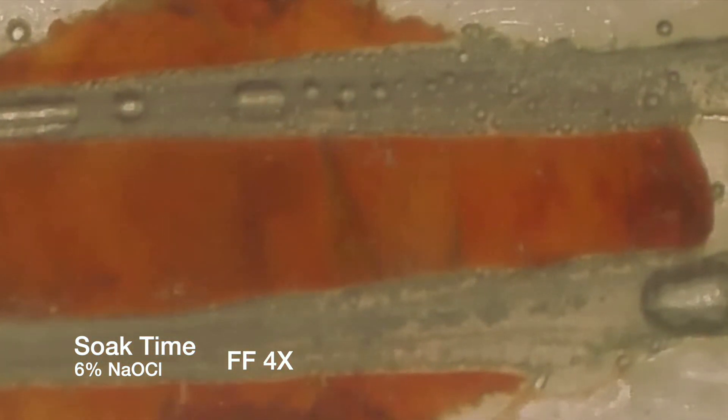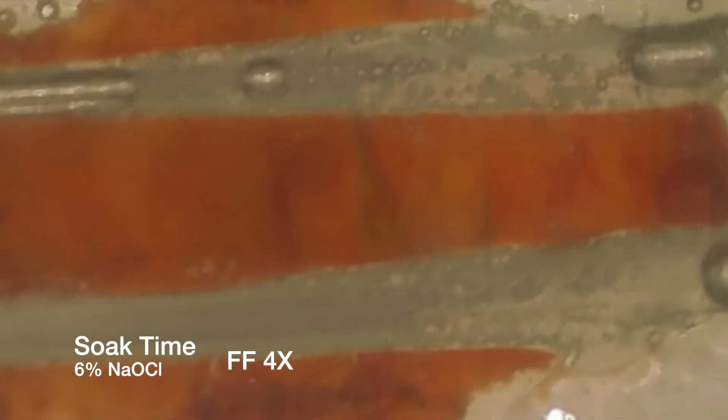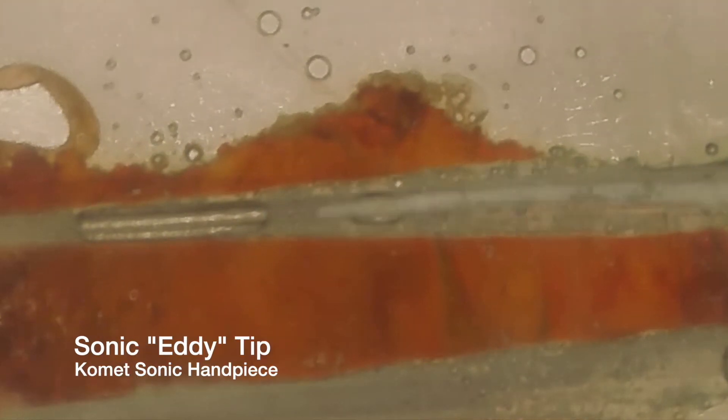If you're going to do passive irrigation, this is one way to do it. Most of us, I think, do the activation at the start and then depend on soaking for the 30 to 40 minutes that we know it takes in a root canal.